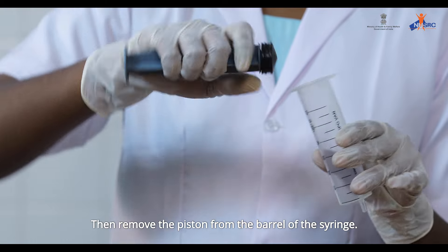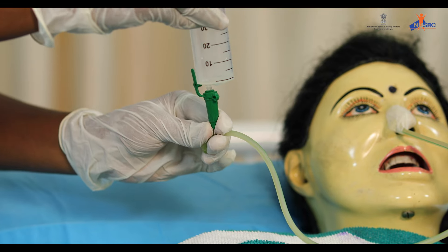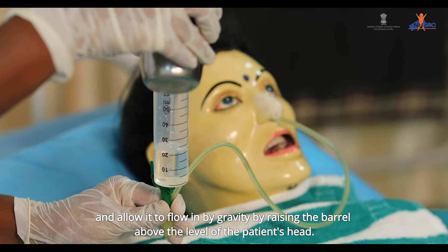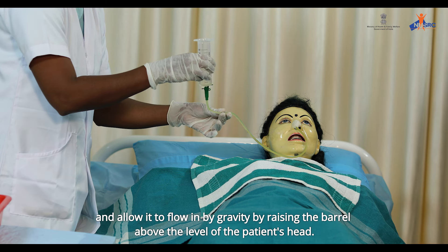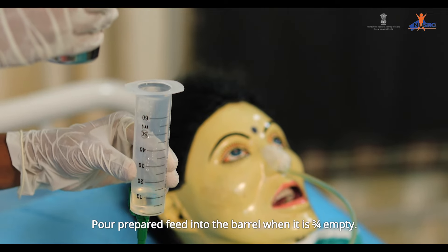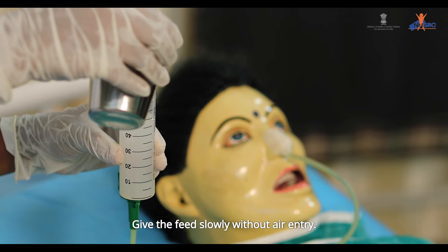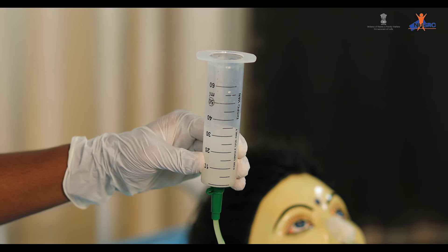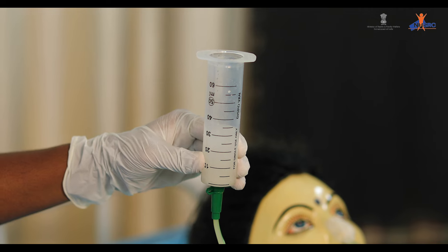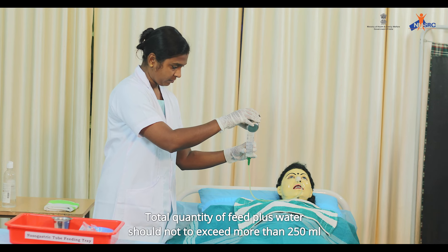Remove the piston from the barrel of the syringe. Pinch the feeding tube and attach the barrel of the syringe to the tube. Fill the barrel with 25 ml of water and allow it to flow in by gravity by raising the barrel above the level of the patient's head. Pour prepared feed into the barrel when it is three-fourths empty. Give the feed slowly without air entry. Give a total of 200 ml of prepared feed.